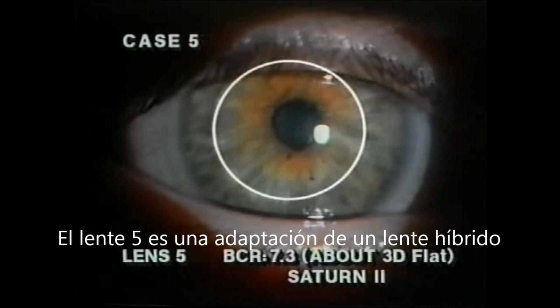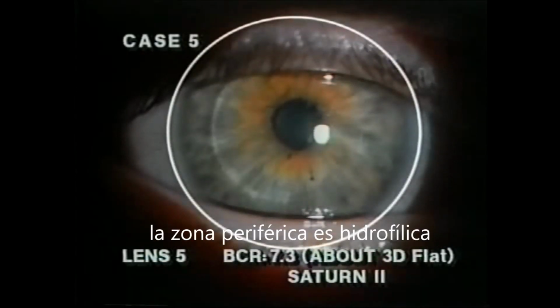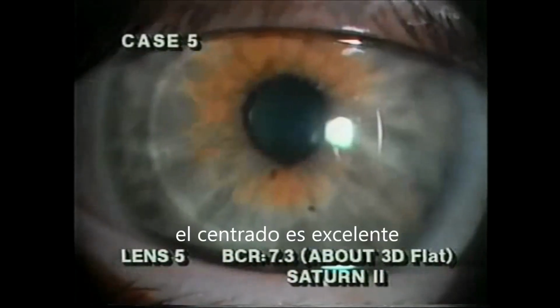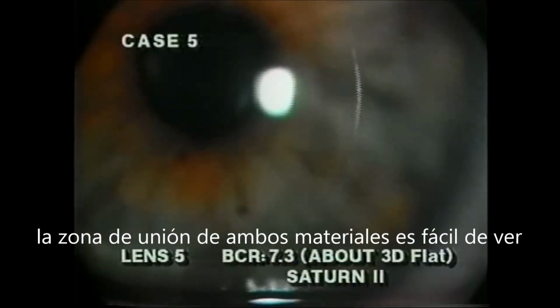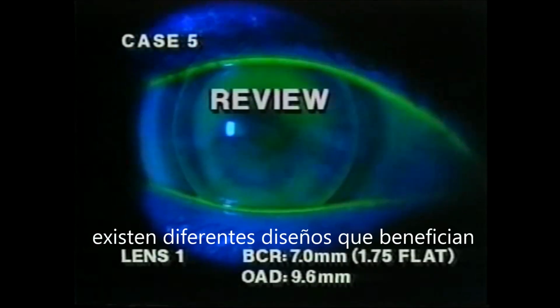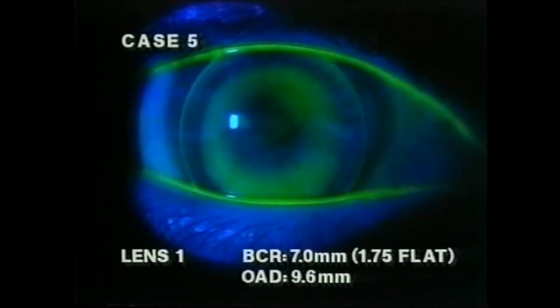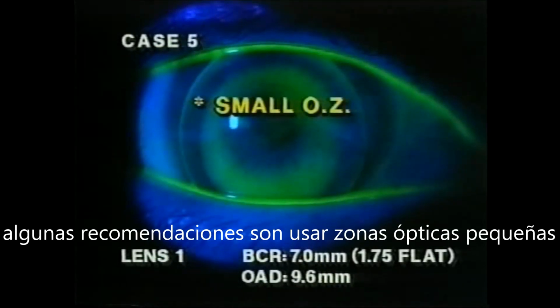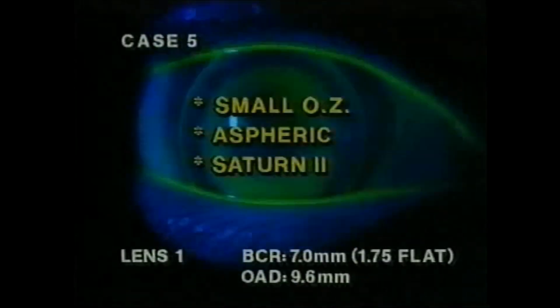Lens number 5 is the Saturn II lens with a rigid gas permeable styrene-based center and a 25% water content skirt. Centration is excellent. Lens lag is minimal with the blink. The junction between the rigid and soft materials can be easily observed under high magnification. In summary, there are several lens designs that can be beneficial in fitting an irregular cornea. These include the use of a small optical zone, an aspheric design, and a Saturn II lens.